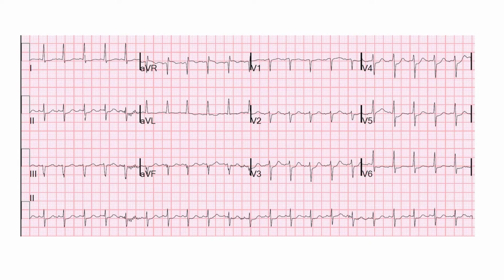In the beginning, this is the first heartbeat, and it's the same heartbeat as this one, which is being read from lead 2, and this one, which is being read from lead 3. The morphologies look different because the electrical activity is being picked up from a different lead perspective. Then we have our second heartbeat, third heartbeat, fourth, fifth, it looks like the ECG machine switches leads here into AVR, and on this row it switches to AVL and AVF.